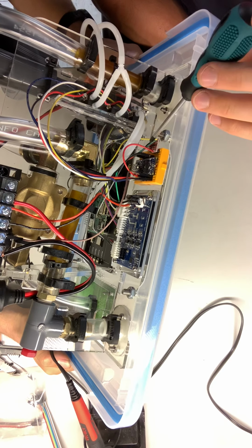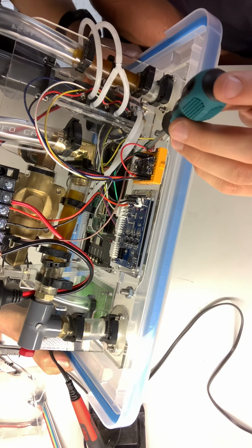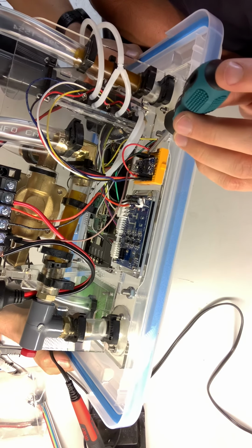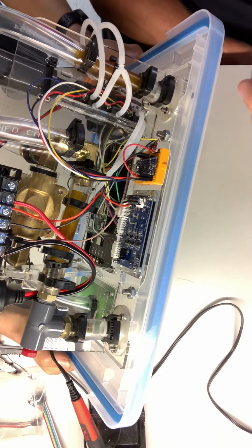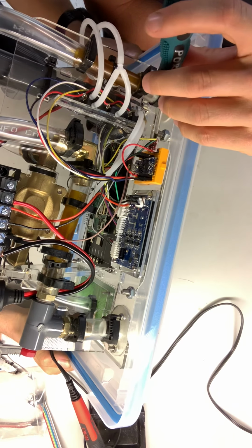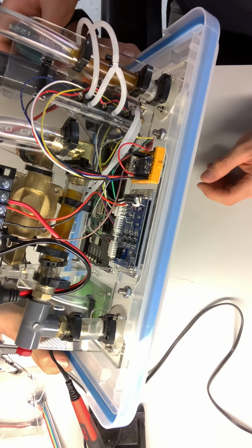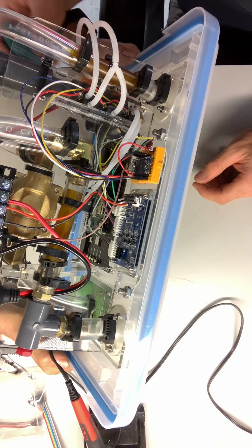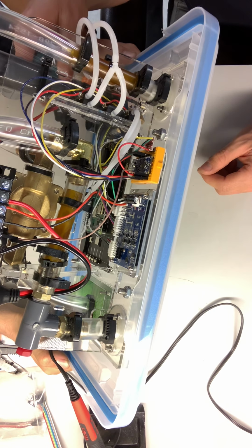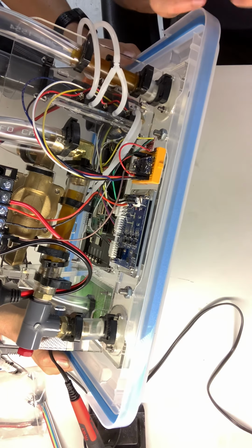We have power on the 3rd, and then on the 4th we just have the ground, which is just grounded through the breadboard. Is the Pi grounded? The Pi is grounded. Well, it's grounded here to the other side of the level shifter, which is grounded to the Arduino. Yeah, and it's grounded to the power supply here through the USB. Through the USB, okay. Through the screen, and then to our bus bar ultimately up here, okay.